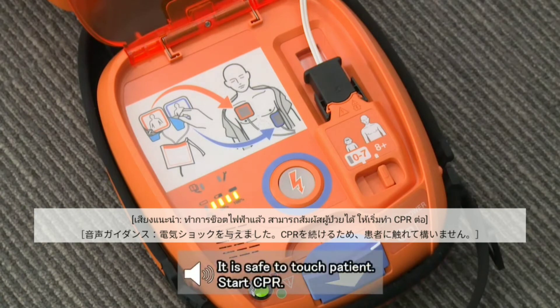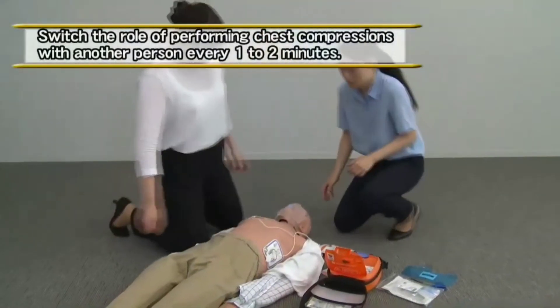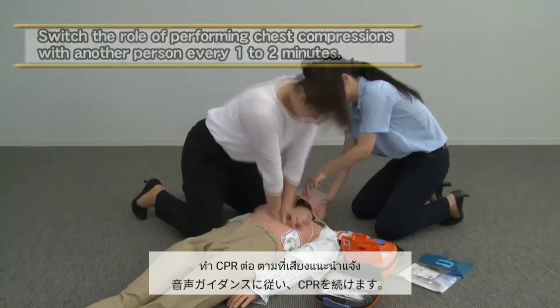It is safe to touch the patient. Start CPR. Resume CPR according to the voice instruction.